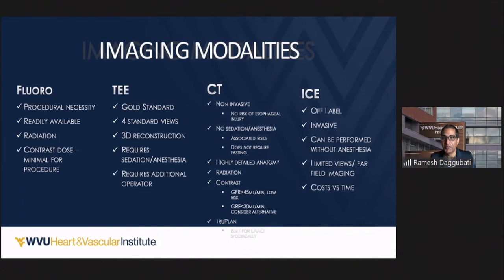But then again, we detected that more device-related thrombosis were being reported by CT because our CT imagers did not know how to evaluate this WATCHMAN Flex device with more PET covering. And therefore, some of the skirts that are seen or a PET layer is reported as DRTs. And so we went back to using TEE now in post-device assessment, but CT can be used.